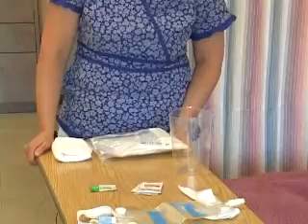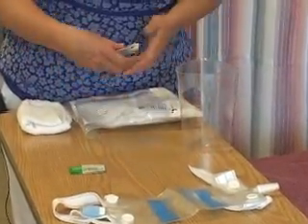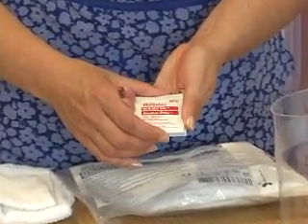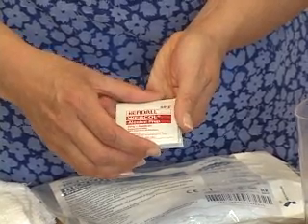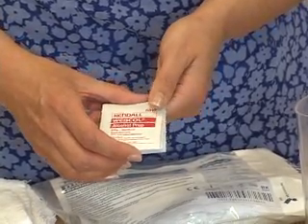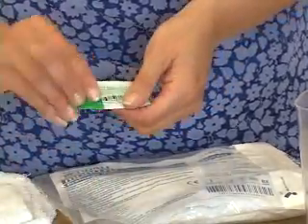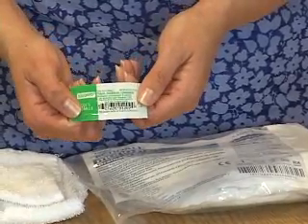First, let me show you some supplies that you will need that we will provide for you to go home with. First of all, hygiene is very important. We will provide for you alcohol prep pads that will be used to cleanse the valves on your drainage bags, and also, even more importantly, the sites where your catheter connects to your drainage bags before and after any bag change. We'll provide for you triple antibiotic ointment that is used after you have cleansed yourself to help promote comfort and prevent infection.